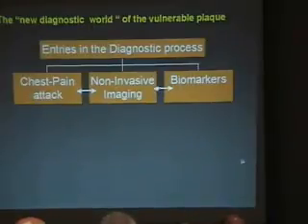The second is a well-known individual. He has made his multi-slice CT scan public domain. That's Pim de Feyter. He's showing his multi-slice CT scan. There is clearly a soft plaque in the proximal LAD. There are nodules of calcium pinching a diagonal, and he's living with these pictures of multi-slice CT scan.